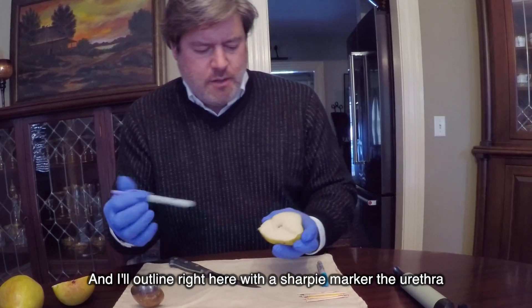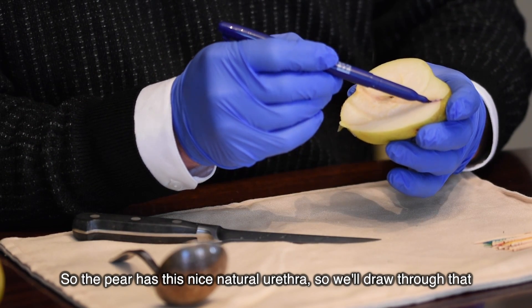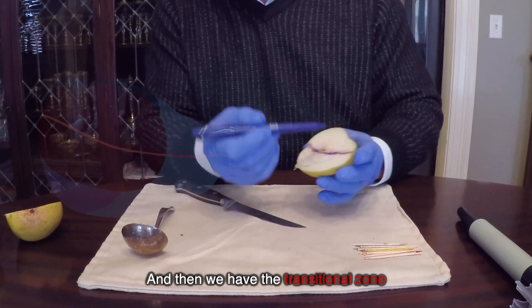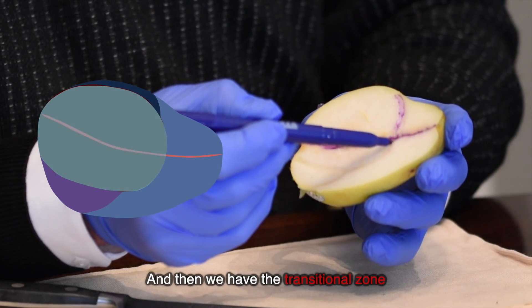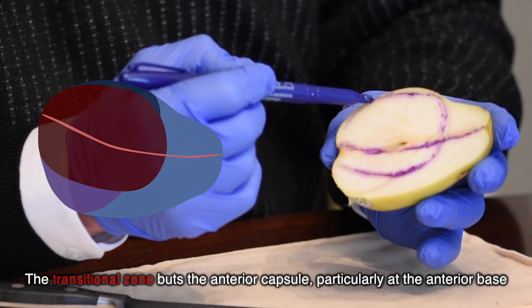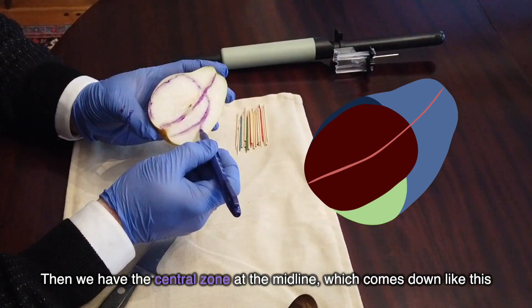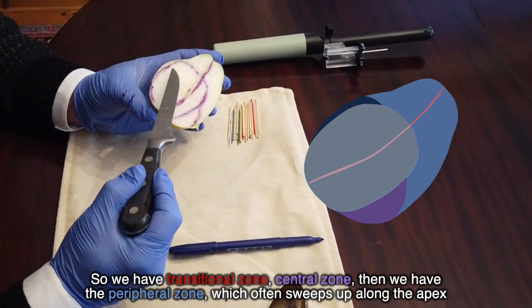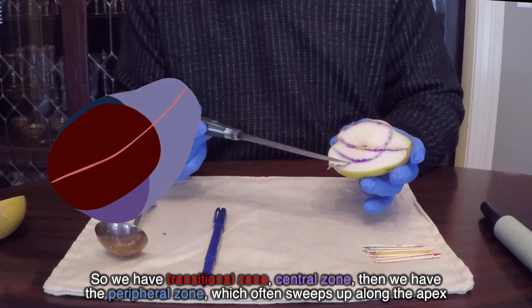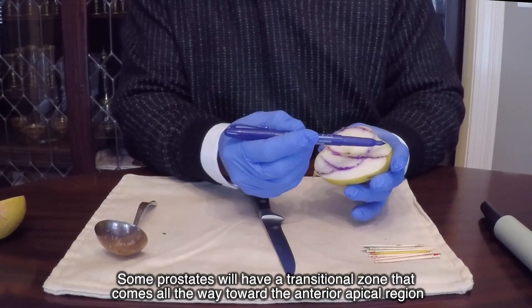This half of the pear almost has a natural urethra in it. I'll outline right here with the sharpie marker the urethra — the pear has this nice natural urethra. Then we have the transitional zone, which comes through like this and abuts the anterior capsule particularly at the anterior base. Then we have the central zone at the midline which comes down like this. So we have transitional zone, central zone, then the peripheral zone which often sweeps up along the apex.